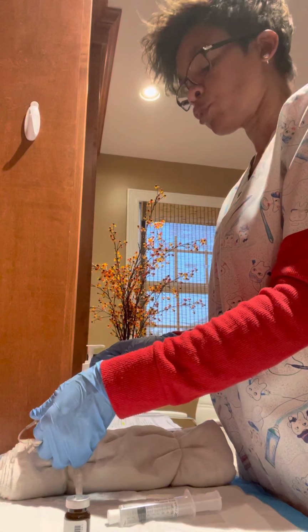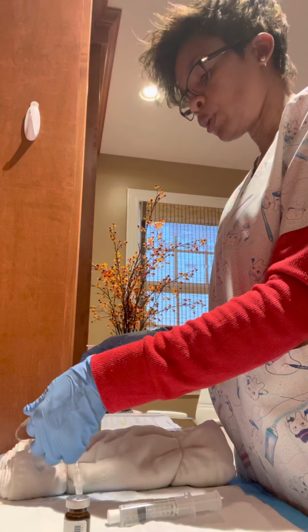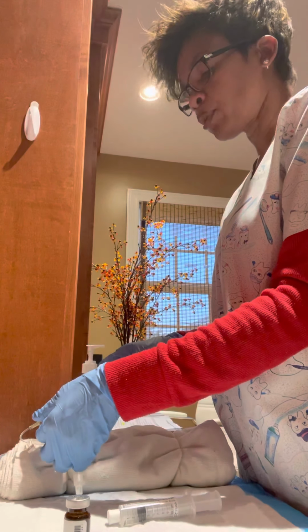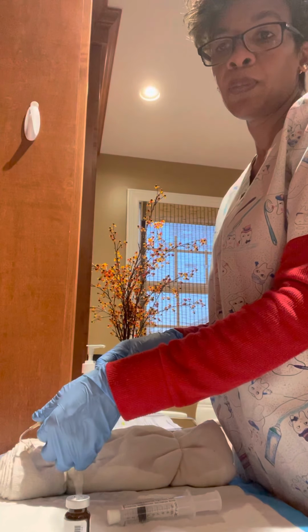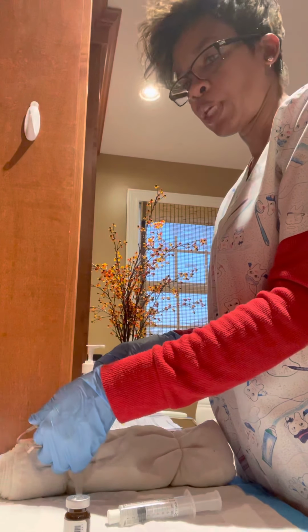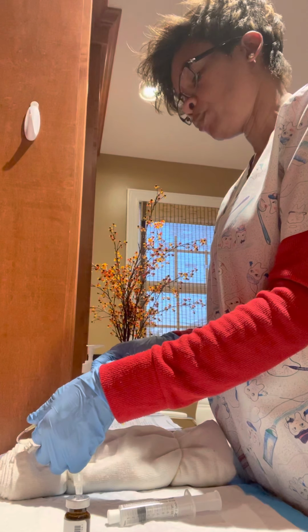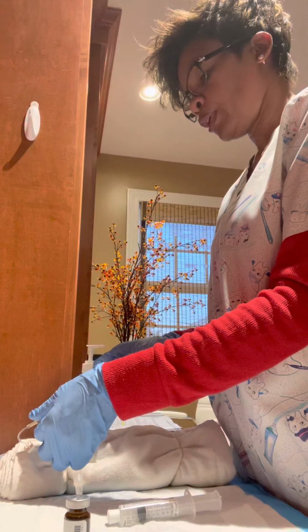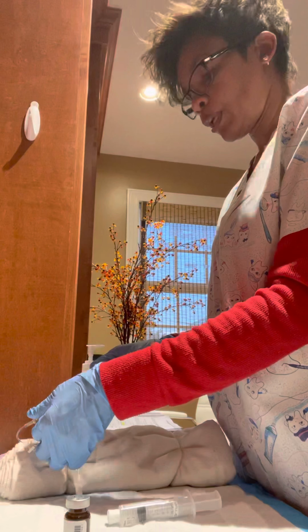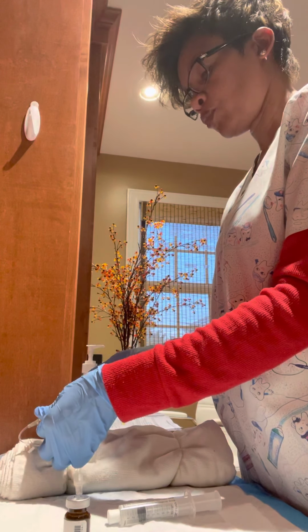And while I'm talking to her and infusing the medication slowly, I'm also looking at the site. And I did check to make sure that her IV dressing was, the date was current, and it is today's date, the 21st. So everything looks good. And just about a minute. Okay, and everything looks great.